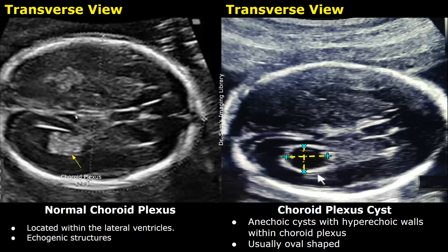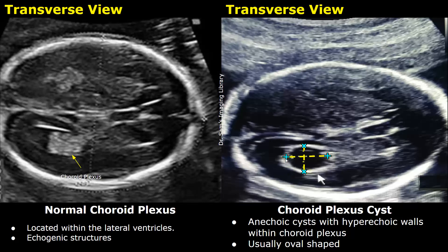The image on the left is a normal image of the brain focusing on the choroid plexus. This is a normal choroid plexus — an echogenic structure located within the lateral ventricles. This is an image of a choroid plexus cyst. A choroid plexus cyst can be associated with Trisomy 18 if other features are also seen. If it is an isolated finding, it is less likely to be associated with Edwards syndrome and usually resolves on its own. There is an anechoic cyst within the choroid plexus, and the cyst will have hyperechoic borders and is usually oval shaped.